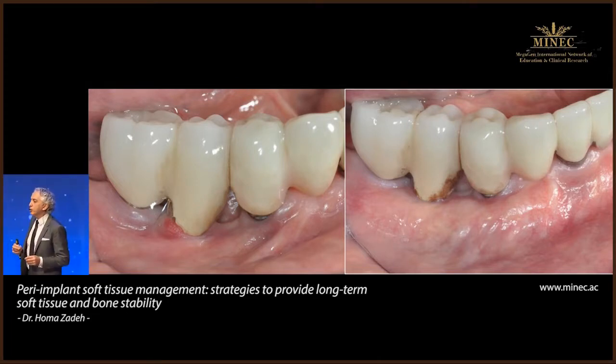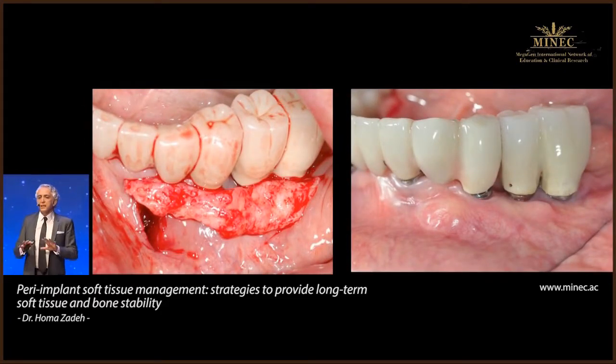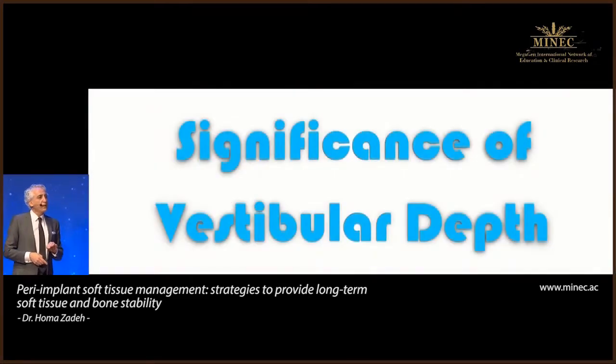So just thickening the mucosa was helpful in reducing the inflammation and making those areas not bleed. So we did the same thing on the opposite side, and as you can see, the tissues look very healthy, despite the fact that there's no surface keratinization. So in my view, what is important is really not the surface keratinization, which is on the oral side. What we really should care about is what is attached on the implant side and whether or not that mucosal thickness is adequate to establish a very stable biological width.